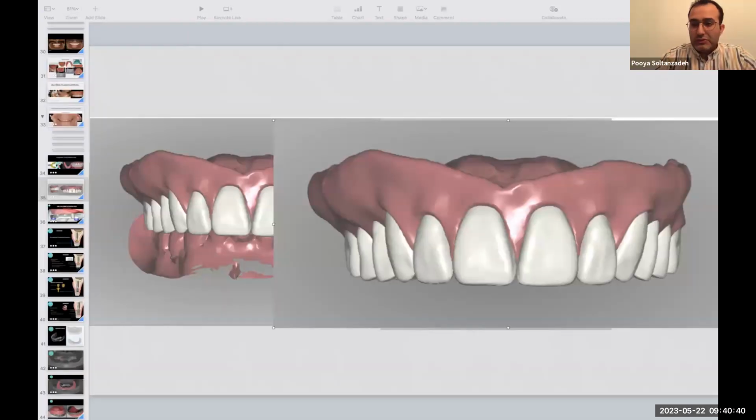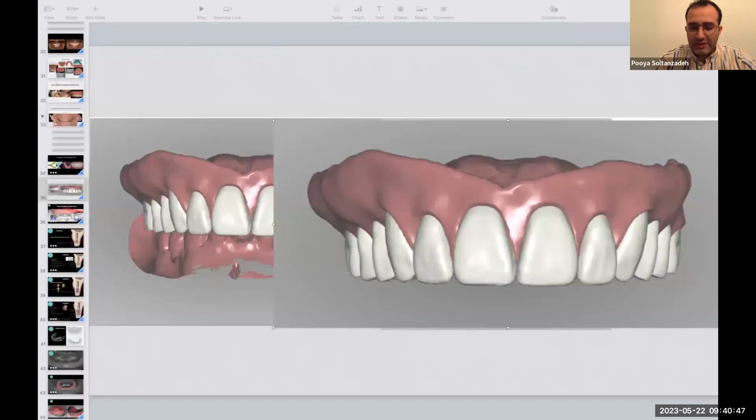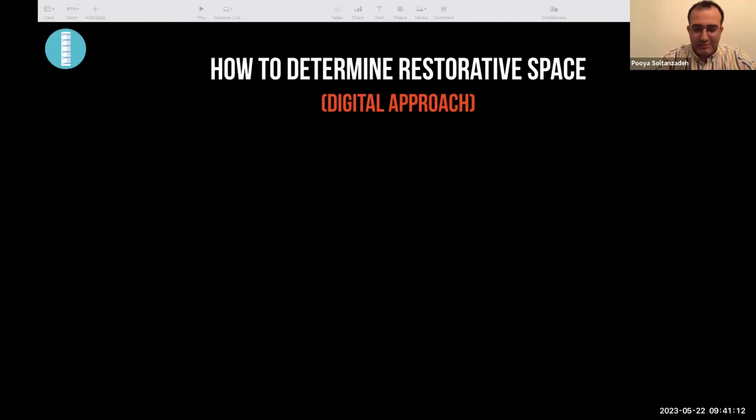But you can also, if the implants are exposed and they already have the locators on, submit it with the scan of those, and they will already hollow out the final dentures for you with that in it. So they already hollow out for you. It makes everything so much easier. Super easy. It's just a matter of doing a few cases with them, and as clinicians, you do that and you will love it.